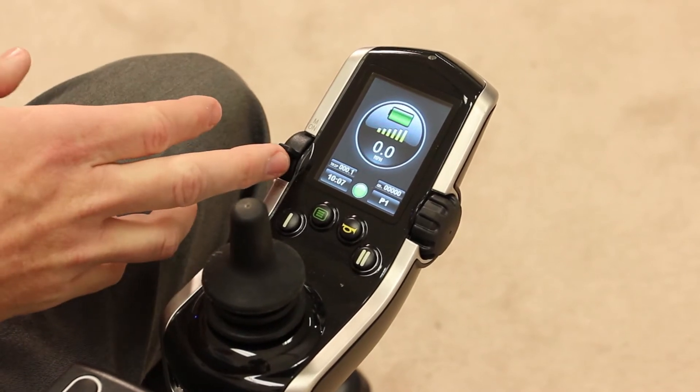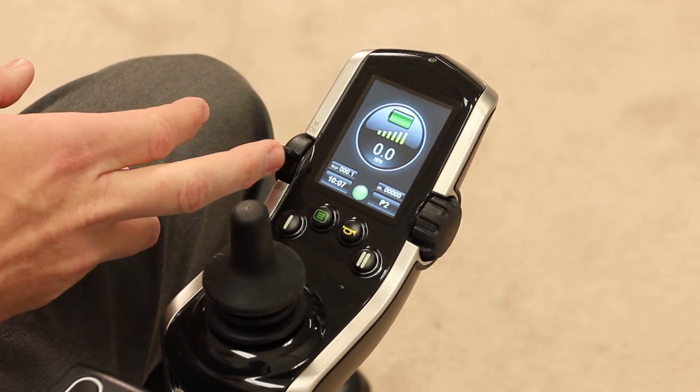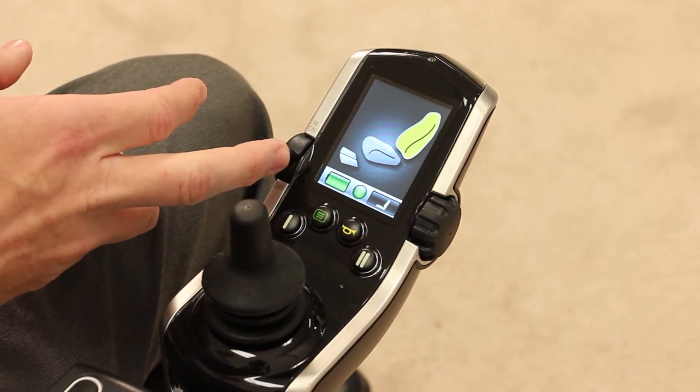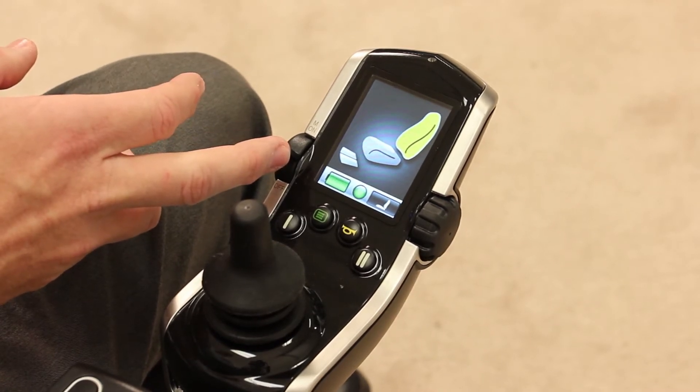You'll notice we changed profile 4 to an auxiliary profile. So there's P3 — it goes right to our seat profile because we haven't turned on the Bluetooth feature yet.